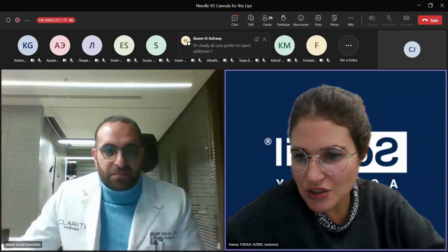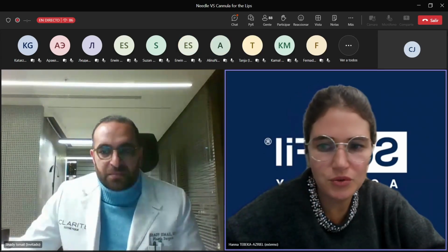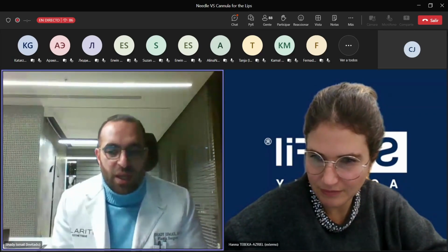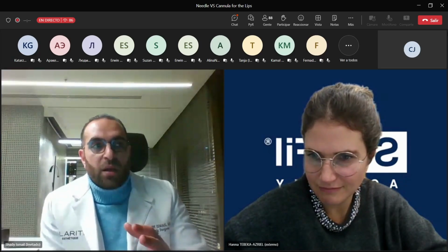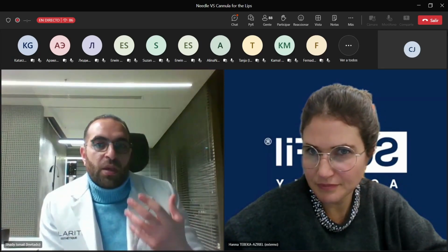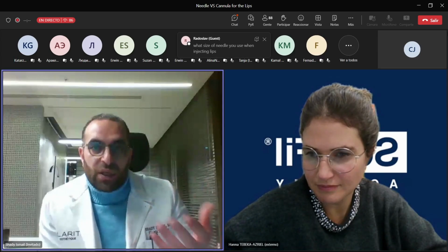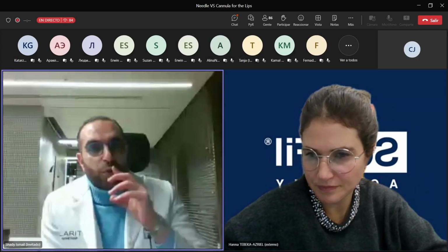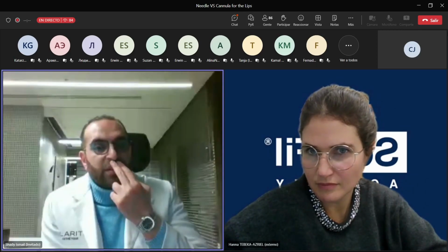Okay, so we have a question, whether you prefer to inject the philtrum. Yeah, as I just answered now, usually I don't do it because it will be overdone. Just injecting the lower third and injecting just in the JK points, it will extend a little bit and elevate the lip itself.